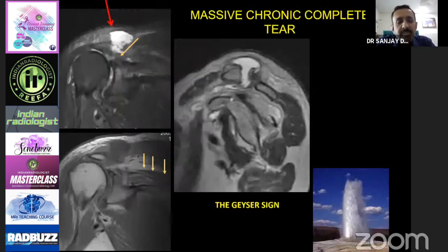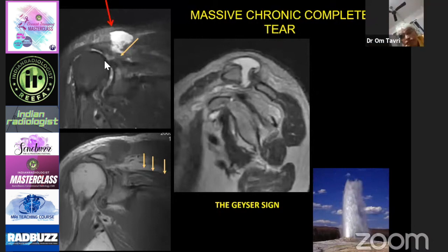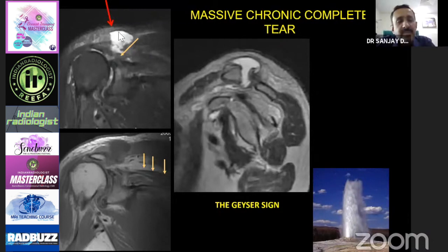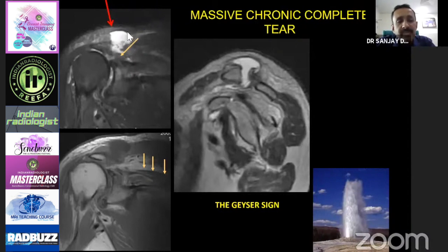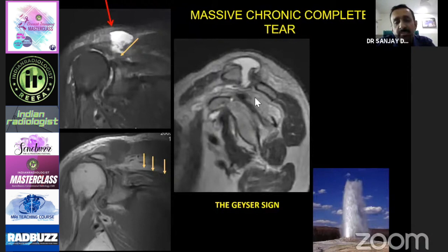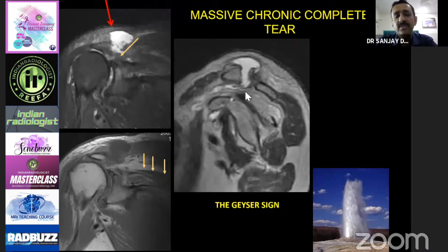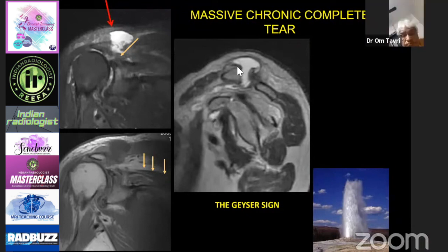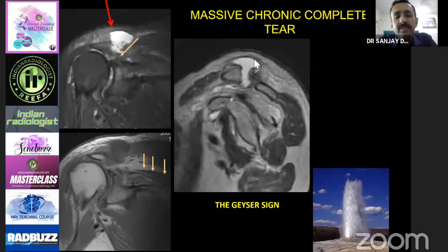With chronic complete tears of the supraspinatus, the humerus shifts upward — superior migration — which constantly irritates the acromioclavicular joint, leading to diastasis or dislocation. The fluid in the subacromial bursa tracks out and forms a subcutaneous cystic swelling overlying the AC joint — this is called the geyser sign. Whenever you see a subcutaneous swelling overlying the acromioclavicular joint, always look for a tear in the supraspinatus tendon.